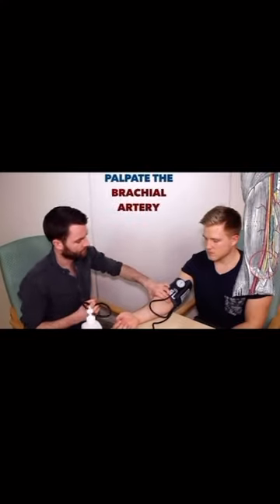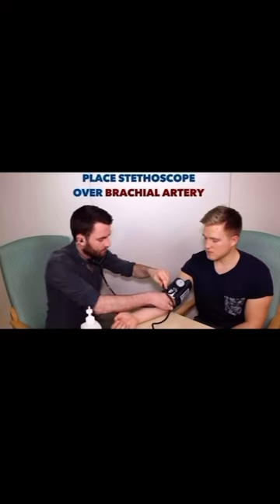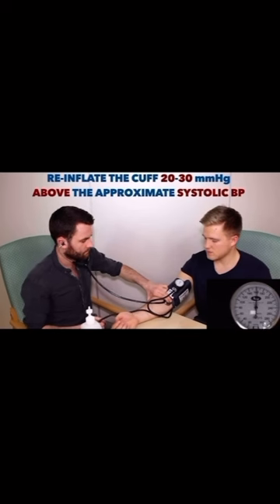Palpate the brachial artery to locate where you will place the stethoscope. Then position the diaphragm of your stethoscope over the brachial artery. Reinflate the cuff 20 to 30 mmHg above the systolic blood pressure you estimated prior.